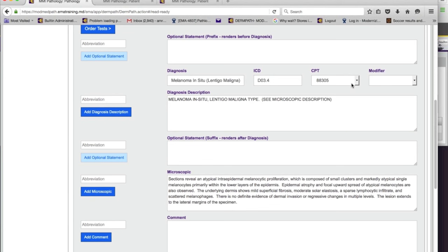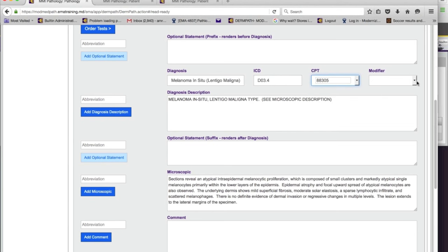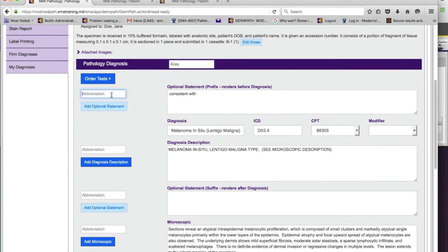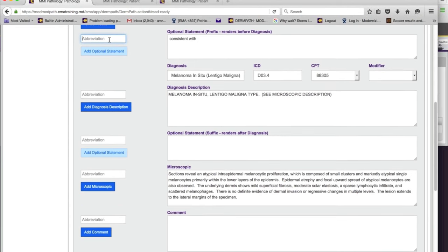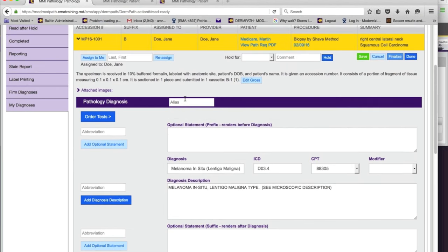Here is the CPT code, which you can always change — for example if it's a consultation. You can change the ICD and CPT code. The modifier is TC or 26. Since we're doing the whole global here, there was no modifier. At any time you can edit from the setup or use macros — for example, typing 'consistent with.' The abbreviations add text to the field on the right. The more macros and abbreviations you set up, the less you'll have to type at the screen at all.